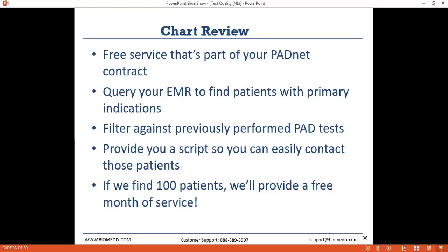And those patients should either be presented with a questionnaire to determine whether or not they have a symptom that means they should be tested for PAD, or they should be assessed with our vascular assessment protocol that we discuss in our Monday webinar to determine whether or not to screen them for PAD and evaluate them that way.